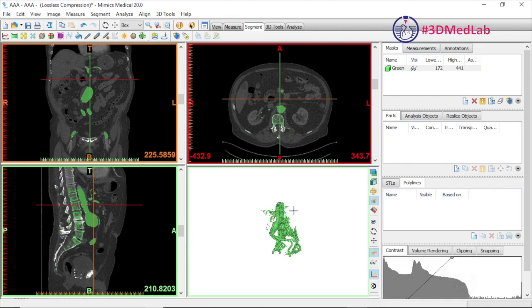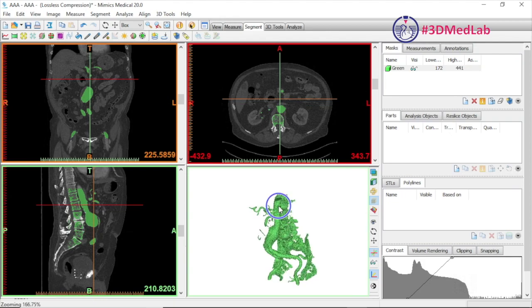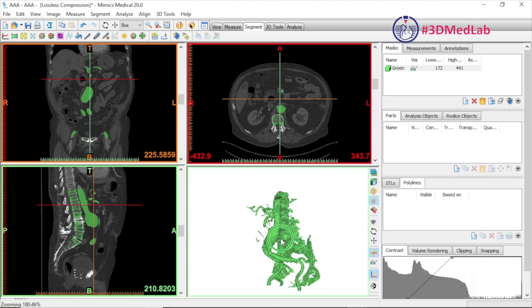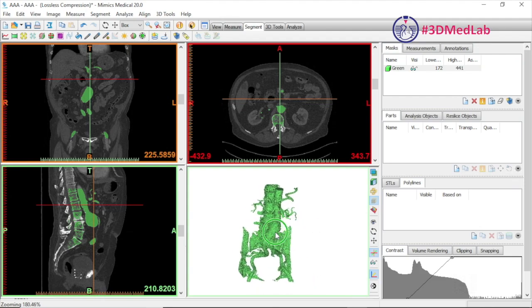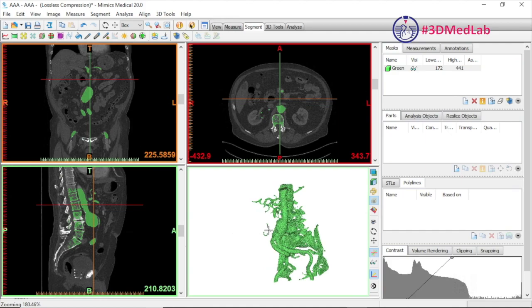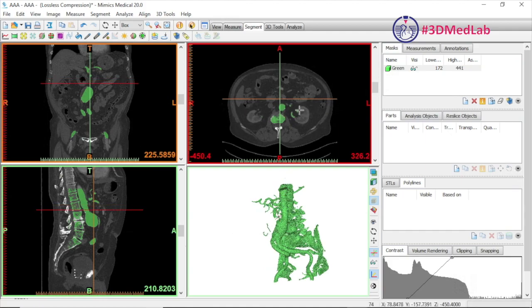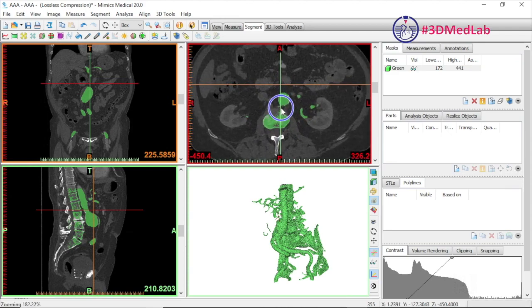We can manipulate our 3D model using the right-click-and-drag function. To zoom in, hold down Control while dragging with the right mouse button, and to pan hold down Shift. You'll see here that the vertebral column is captured along with the aorta, and the reason is that there's a small connection which we'll zoom in on.